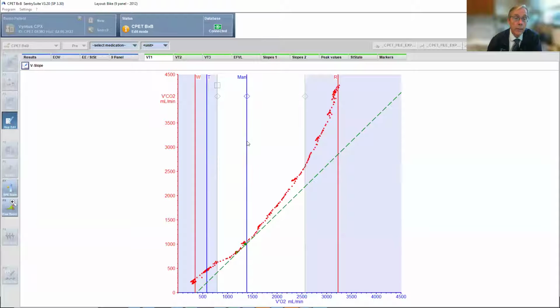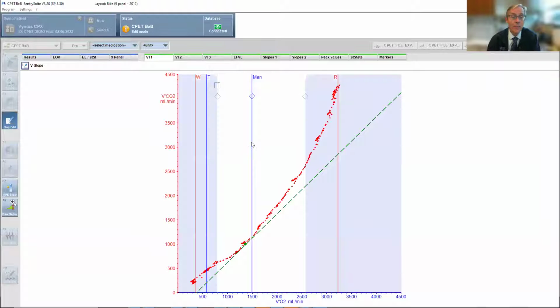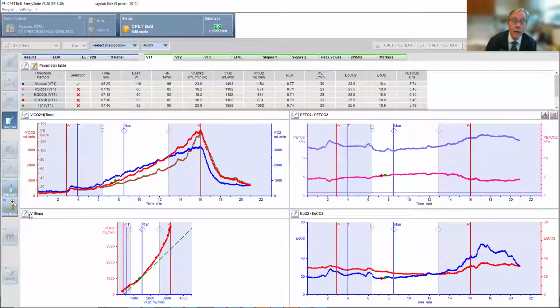And then this will be something you can see on the other graphs, right? That little further over, a little further over. Okay, a little bit further. That's good. Now you're going to look at where that is in terms of the end tidal. Does the end tidal oxygen start to go up when the CO2 is stable? Does the ventilatory equivalent for oxygen go up at the same time as the ventilatory equivalent for CO2? And this actually is a pretty good area of the AT.